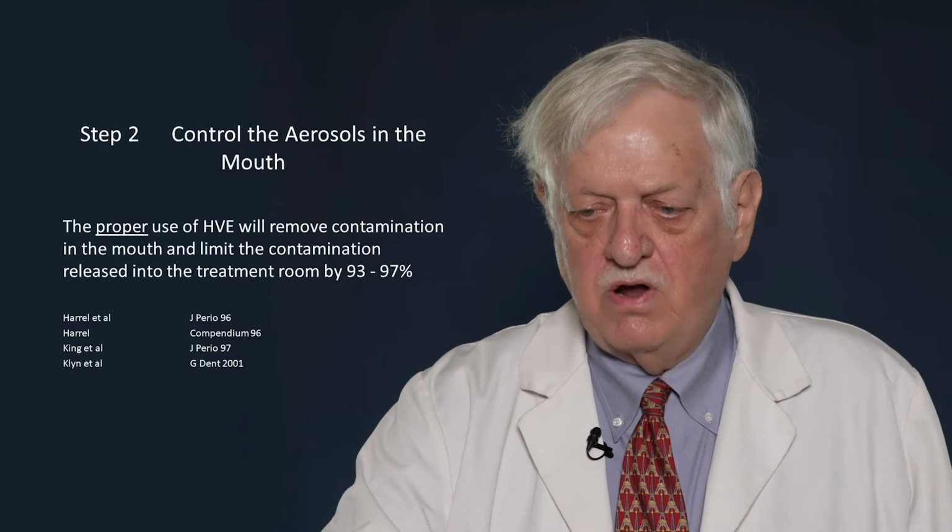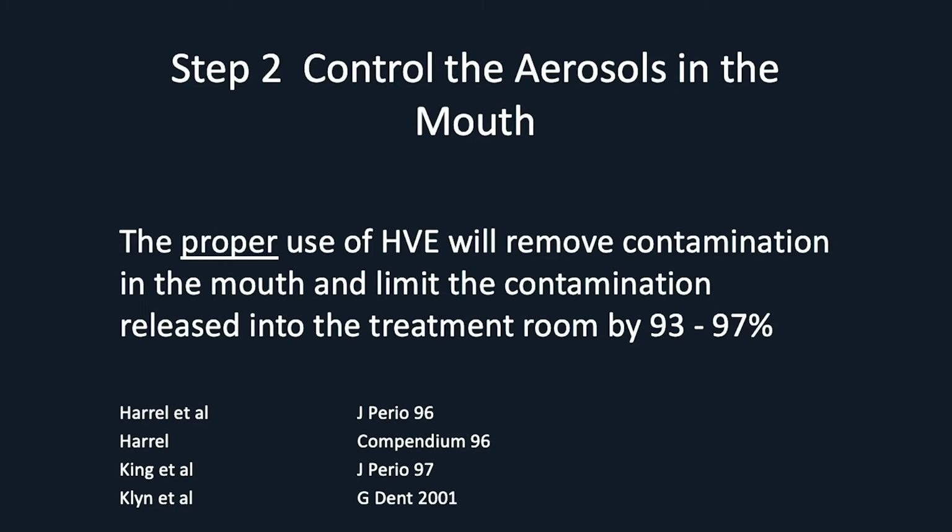It's actually pretty straightforward. The proper, underline proper use of high volume evacuation will remove contaminations in the mouth and limit the contamination released into the treatment room by greater than 90%. My particular research showed 93%. There's several studies out there showing slightly below that or slightly above it. And a few of those are on this slide.